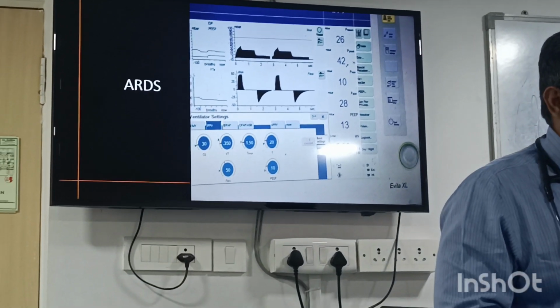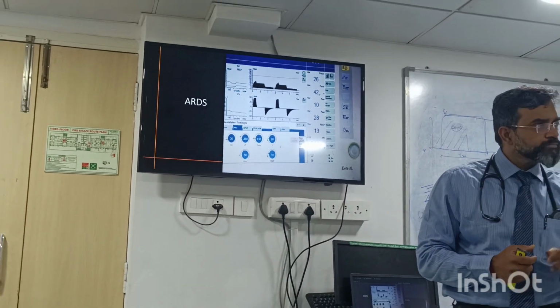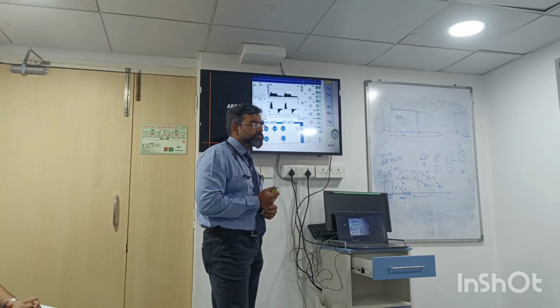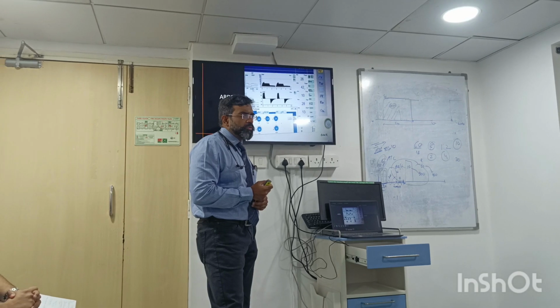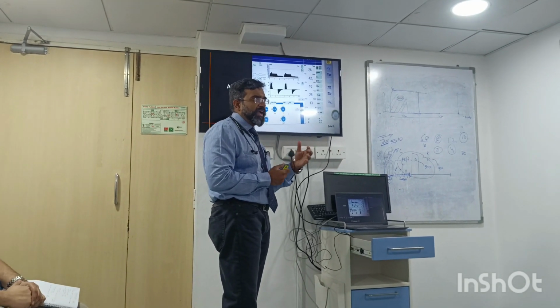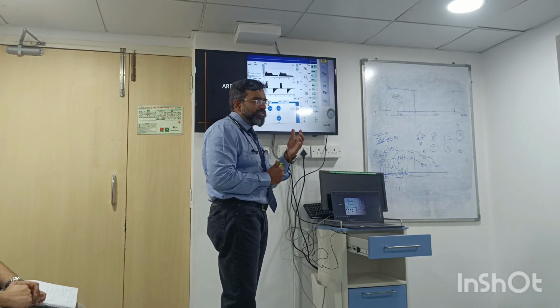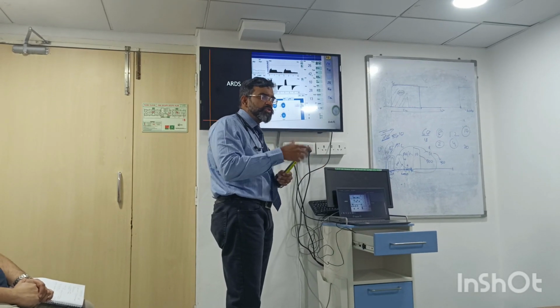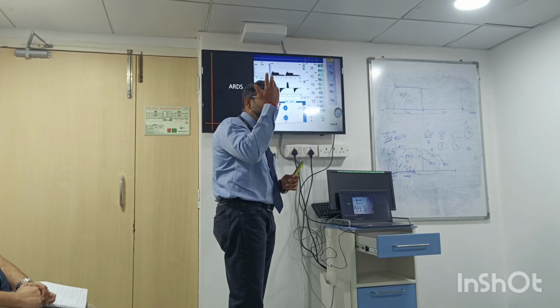Any doubts? So, the way we have a target of plateau pressure in ARDS management, is there any target for P mean? No, for P mean, no. But you can see that when you are increasing, your mean pressure is going up. I want to see whether, whatever I am doing, my mean pressure is changing or not. Because there is a possibility you change your RR, your I ratio is changing, because of which the mean pressure is not going up.